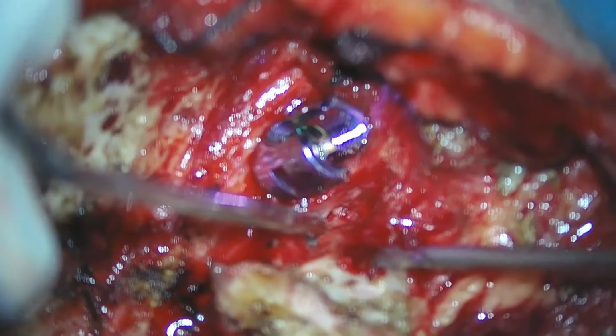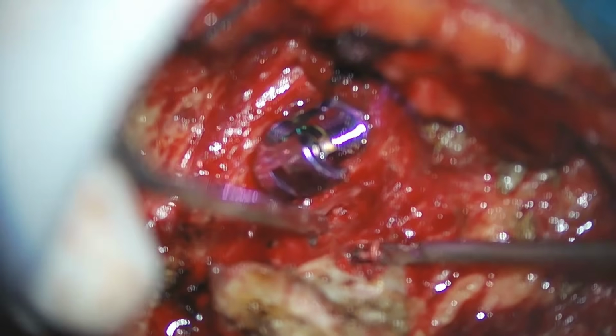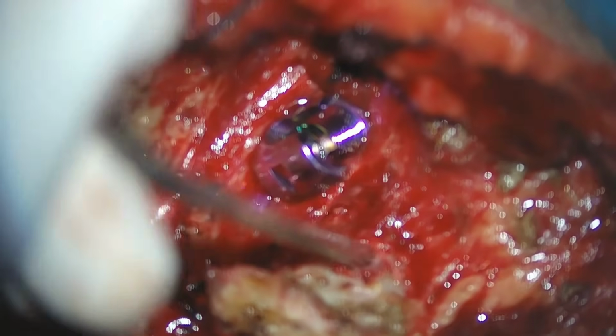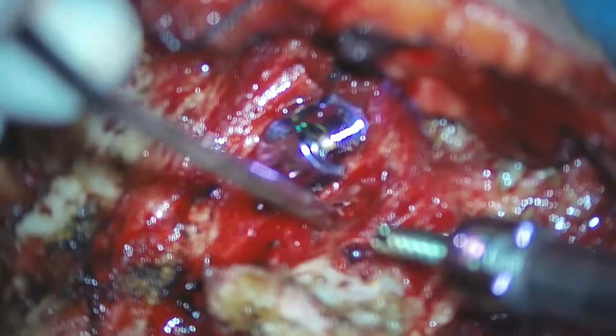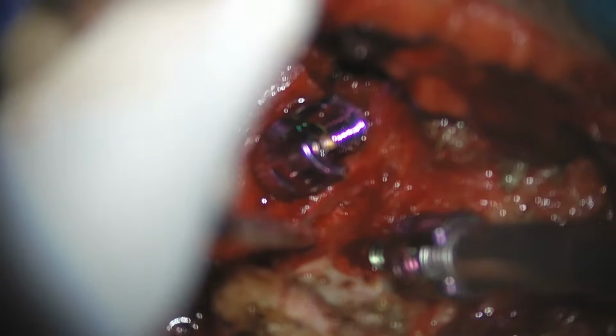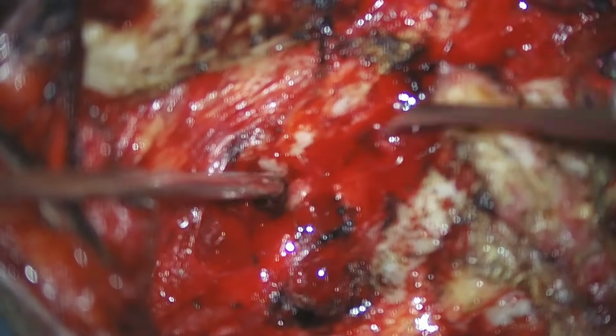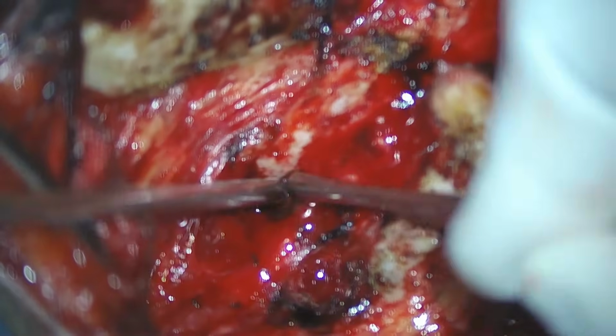The C2 pedicle screw, we do a decortication with the diamond burr, and after carefully watching the direction of the C2 pedicle, we can directly visualize the C2 pedicle direction, and we place the screw in the same direction. Now we again switch to the left side, and we expose the C1 posterior arch and its attachment to the lateral mass.